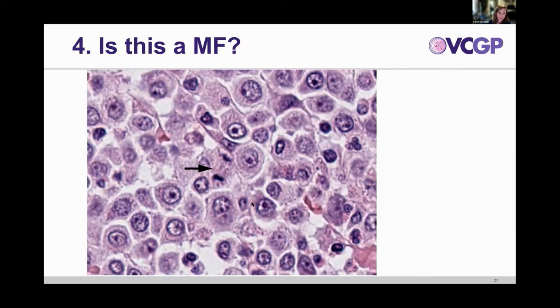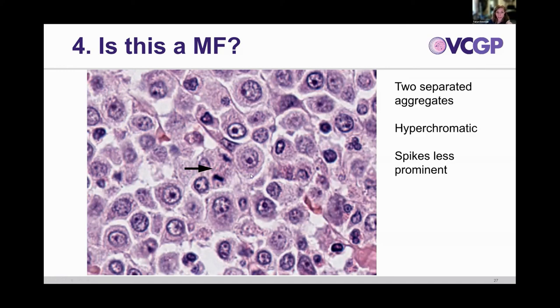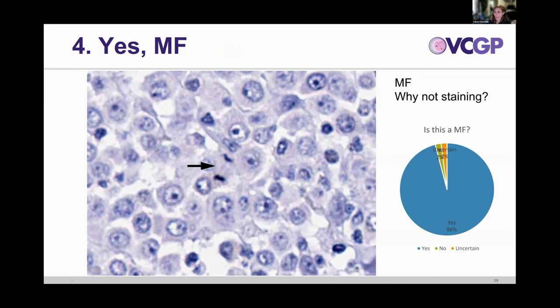Number four is really interesting. This structure is pretty blurry and we don't see the spikes well, but we can see two chromosome clusters being separated — late anaphase or early telophase. The spikes are less prominent but we have the two aggregates. This one got huge consensus — basically everybody said this is a mitotic figure — which I thought was so interesting. But why is it not staining with PHH3? PHH3 — an important point I forgot to mention — loses phosphorylation of histone in telophase. So telophase and maybe late anaphase don't stain or stain variably with PHH3. That's why with this stain you really do have to use the morphology to help you interpret it. Even though it's not staining, I do interpret this as a mitotic figure.